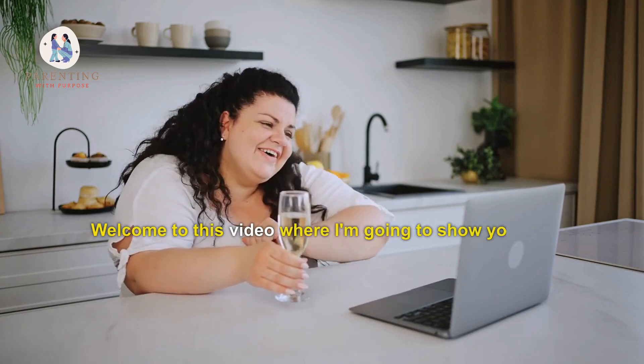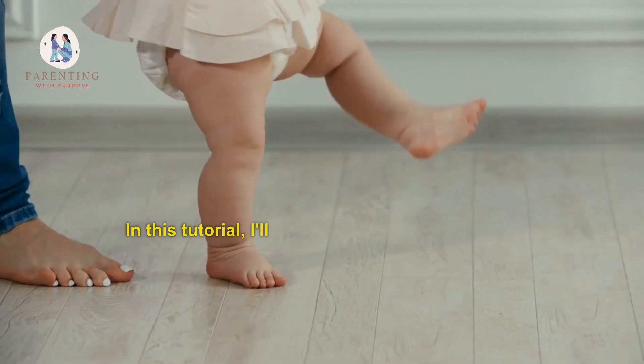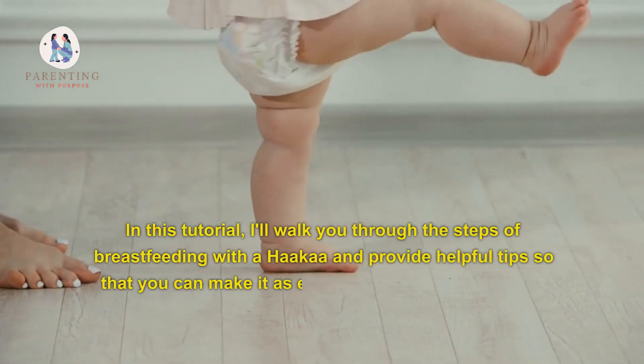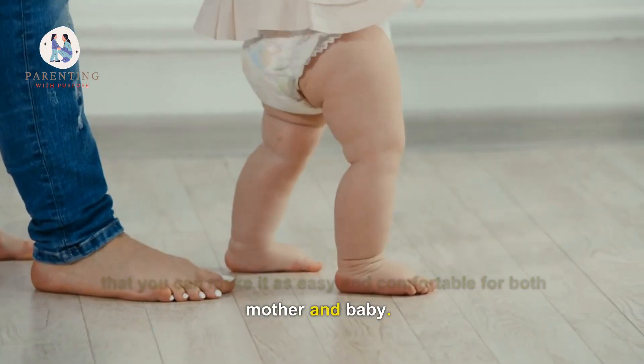Welcome to this video where I'm going to show you how to breastfeed using the Hakaa. In this tutorial, I'll walk you through the steps of breastfeeding with a Hakaa and provide helpful tips so that you can make it as easy and comfortable for both mother and baby.